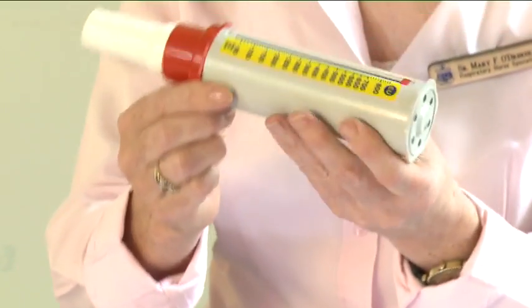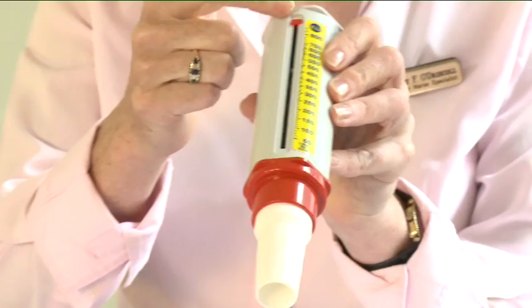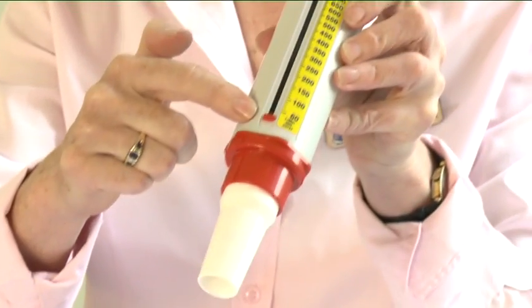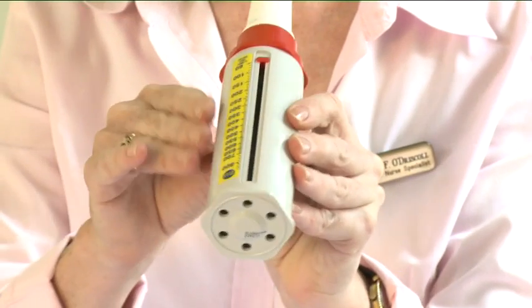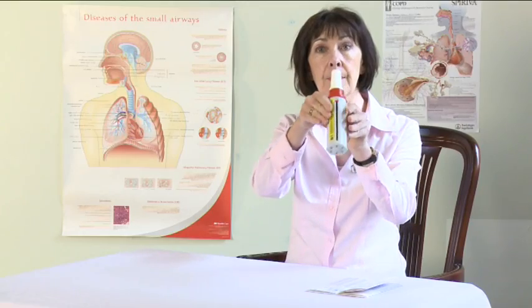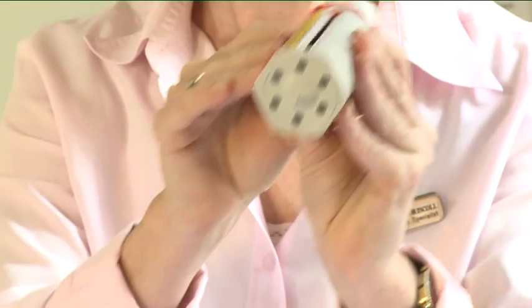To use the peak flow, insert the mouthpiece into the meter. Ensure the pointer is set at zero. Hold the peak flow meter so that your fingers are clear of the scale slot. Do not obstruct the holes at the end of the peak flow meter.